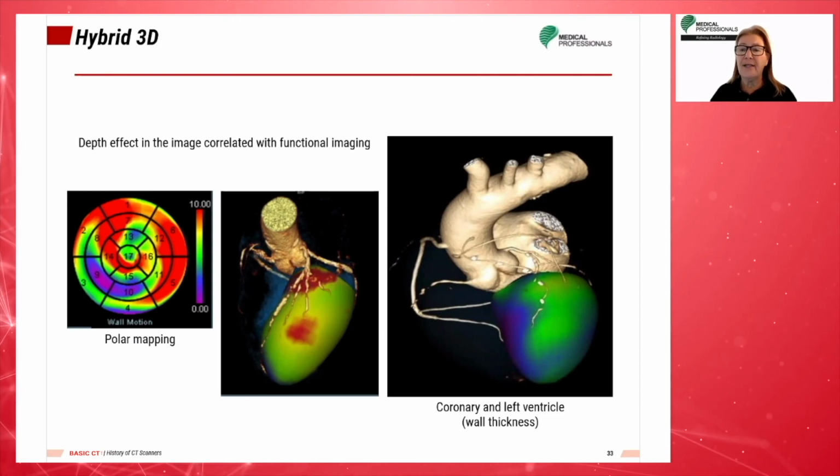In reality, PET-CT scanners are two separate machines in close proximity with a single table that moves the patient between the two. The PET and CT data are acquired sequentially.